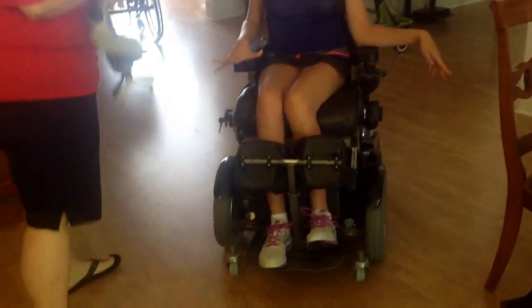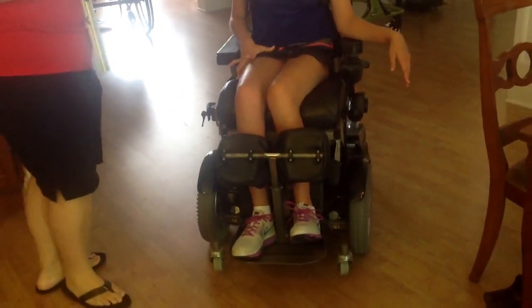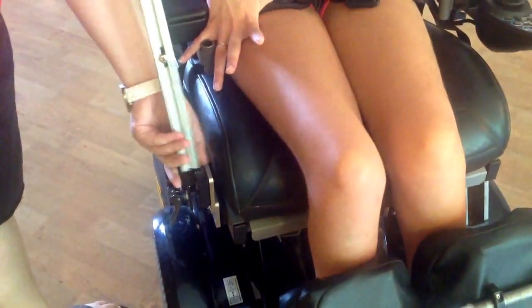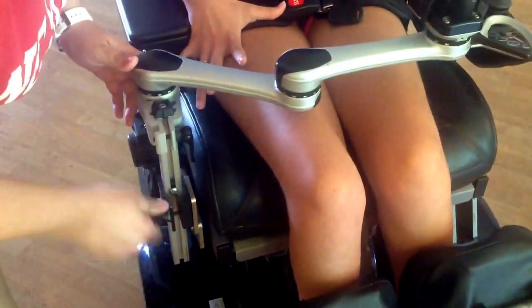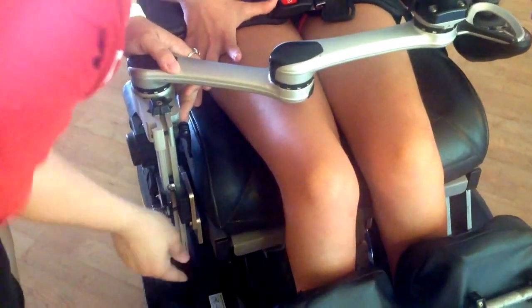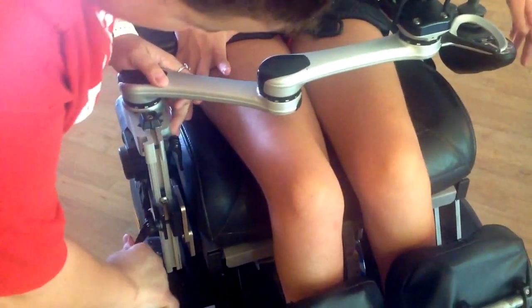This video is going to show you how to put Kay's Echo device onto her chair. On the right side of her chair, where her joystick isn't, there is a little receptacle there that Lacey is finding. And you will stick this stick in there like so, and it slides down. And then there is a little latch that you crank in. You might have it too tight — there we go. So that's nice and snug.